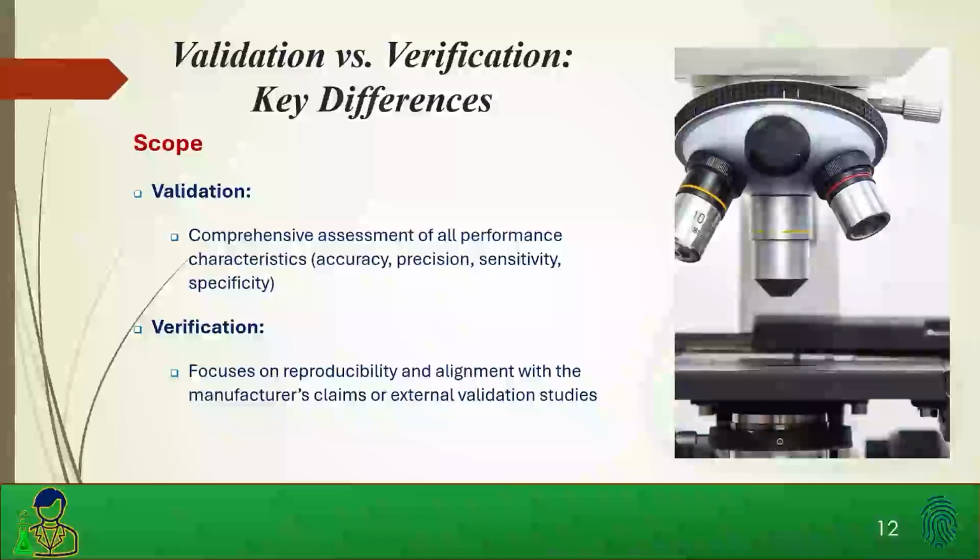It has sample stability, so it has how long the samples are good for at room temperature, how good they are refrigerated, how good they are frozen. So the manufacturer for these assays evaluated the stability thoroughly for those analytes. Also, the package inserts list any interferences that may have been there, which impact the specificity and sensitivity of the assay. They do that thoroughly. They dig through all that stuff. They identify any interferences, any issues with matrix effects, things like that.